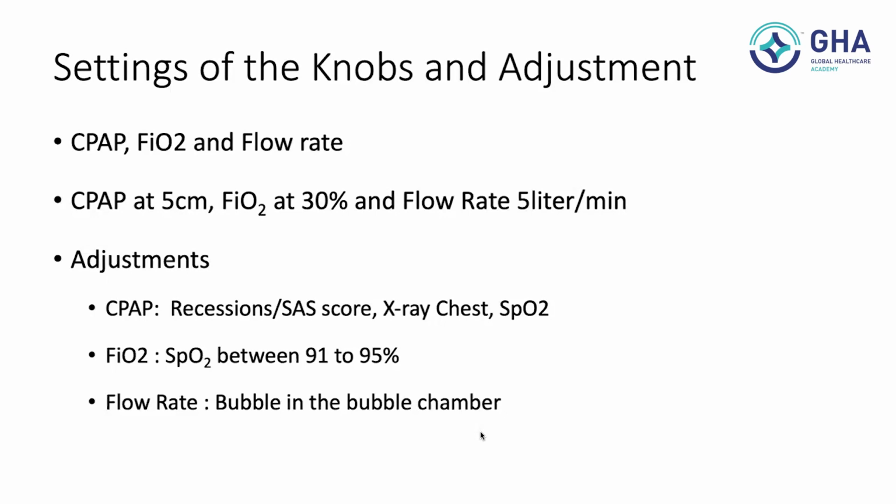So as the FRC improves, you will see a decrease in the Silverman-Anderson score. And the third component, after looking at CPAP pressure and FiO2 flow, is that you should be able to maintain the saturation between 91 to 95%. Subsequently, you wait for 15-20 minutes.